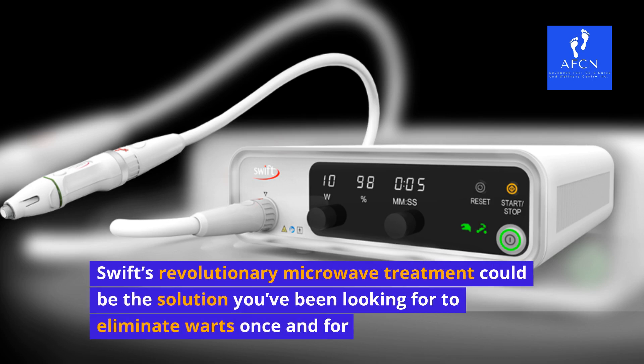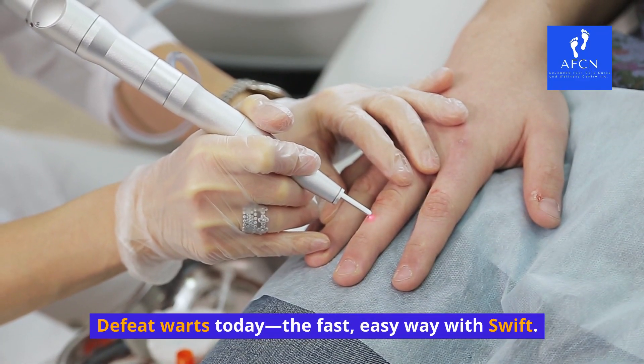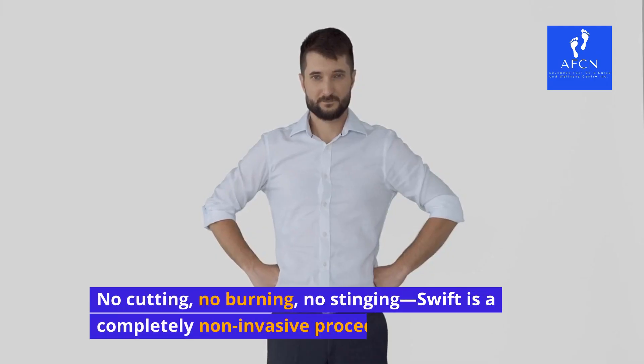Swift's revolutionary microwave treatment could be the solution you've been looking for to eliminate warts once and for all. Defeat warts today the fast, easy way with Swift — no cutting, no burning, no stinging.